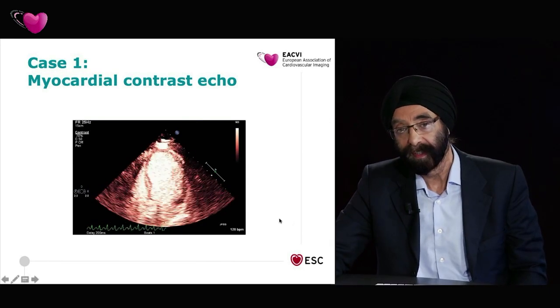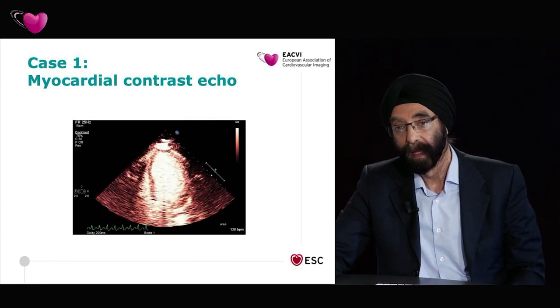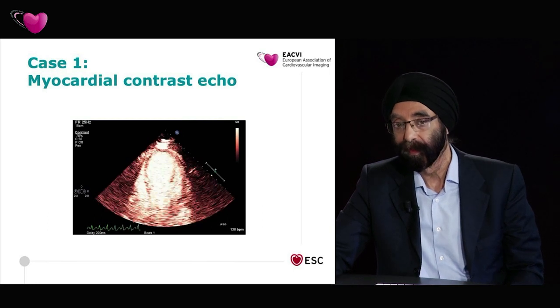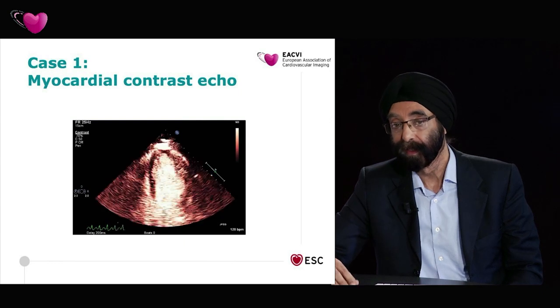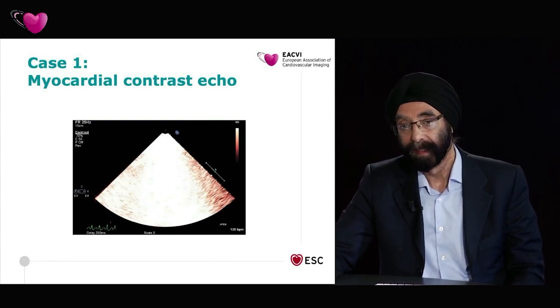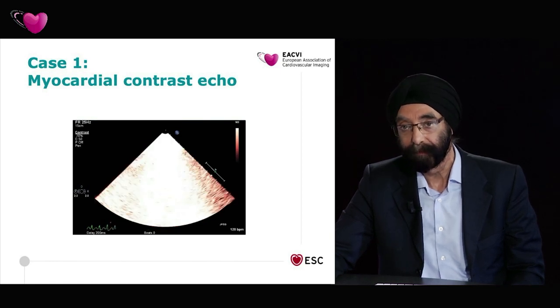So the patient was actually then referred to the cardiomyopathy service. And we agreed that we should do a CMR scan to look for mid-wall fibrosis, and they could do perfusion at the same time as well. So we have CMR perfusion with adenosine, I believe they use.